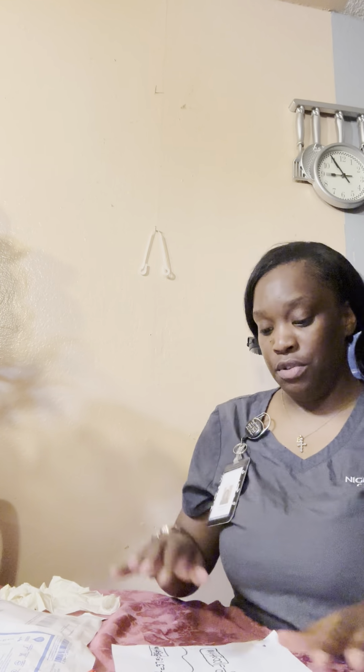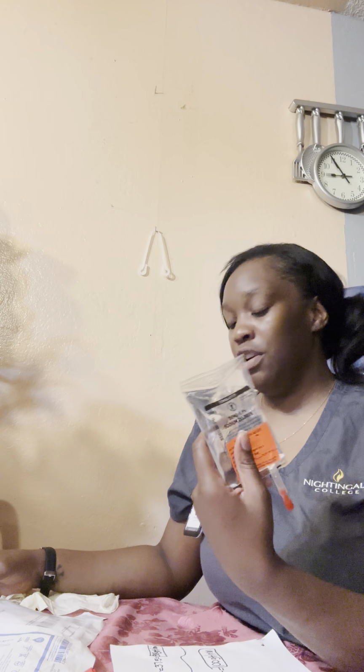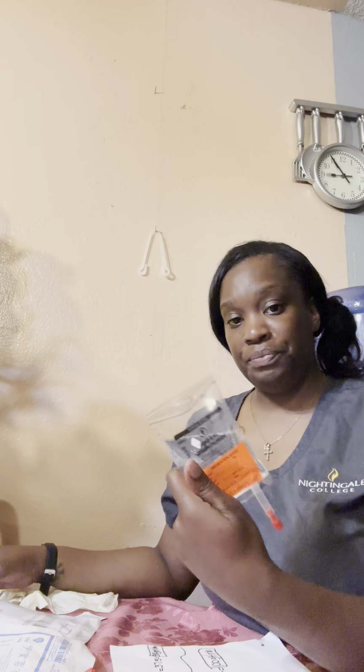So first off, I will check the doctor's order to make sure everything is good and that it makes sense for the patient. I'm going to verify that the order is correct. So the doctor has ordered 150 milliliters of normal saline over an hour, and then also 250 milligrams that comes in 100 milliliters of amoxicillin.